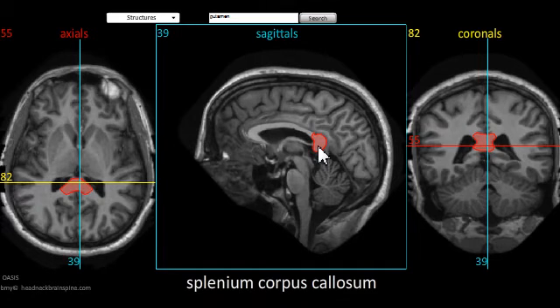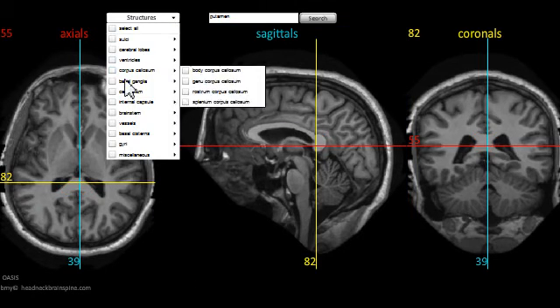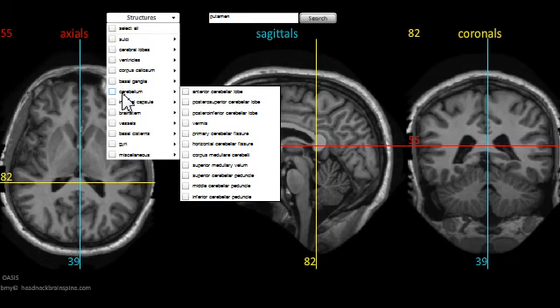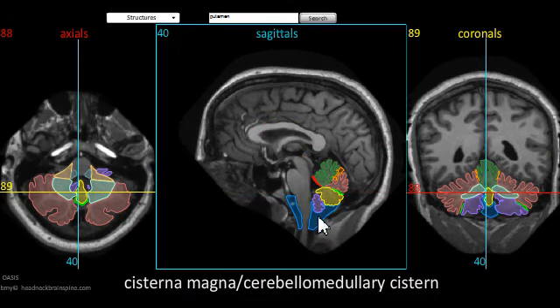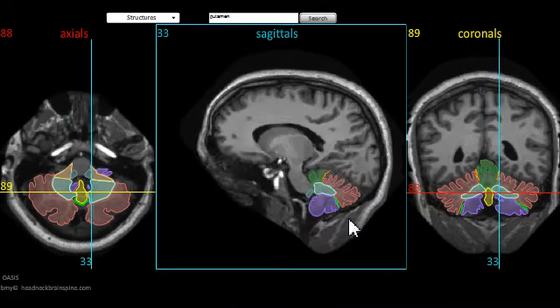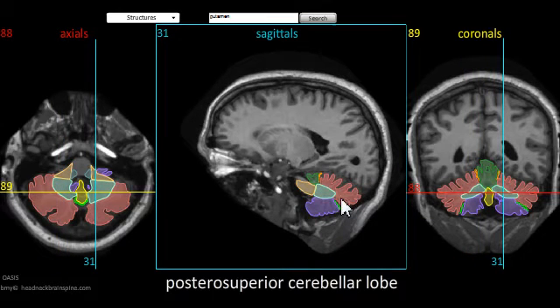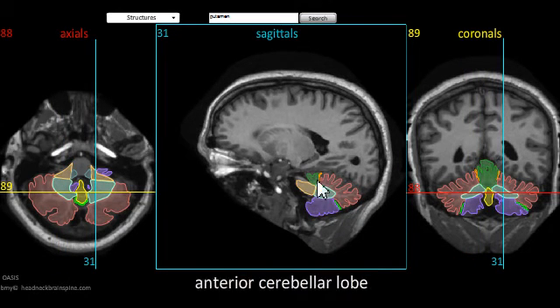Another method — you may want to learn related structures. Say, for example, everything in the cerebellum. Click on the checkbox of the cerebellum. It turns on all the structures, and then they can be appreciated by scrolling through them or moving the mouse over them to see their respective names.